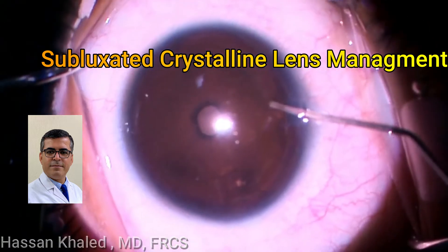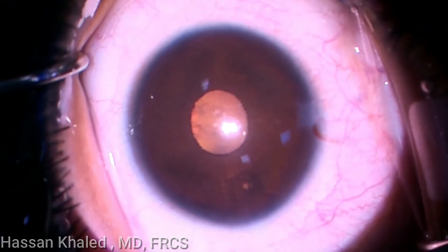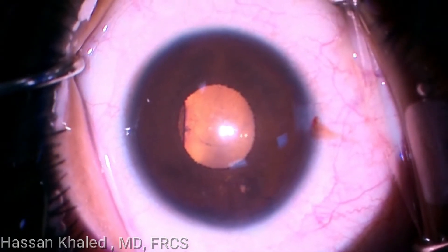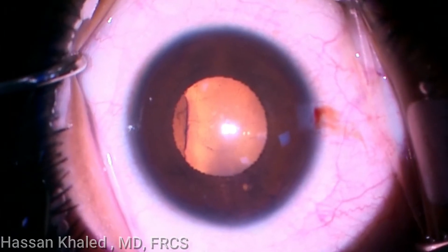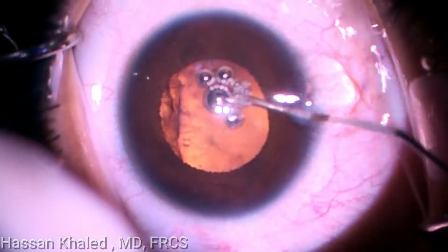Here is a phacoemulsification in a 17-year-old female who has bilateral congenital superior nasal subluxation with dropping of vision in both eyes. Mydriatic adrenaline is used to dilate the pupil. Now the pupil is dilated and the subluxation is clear.